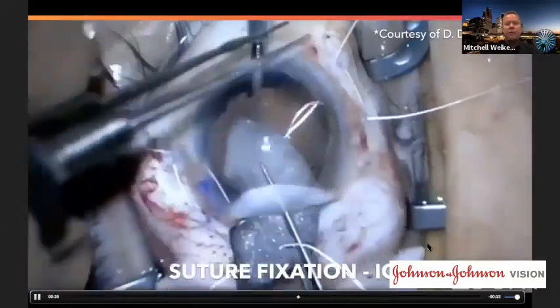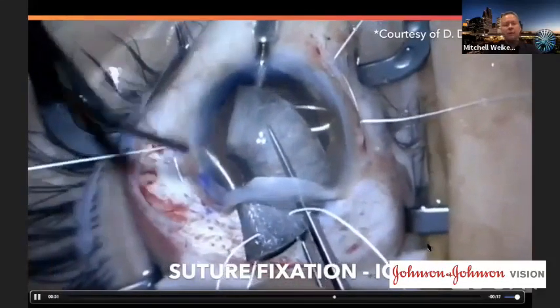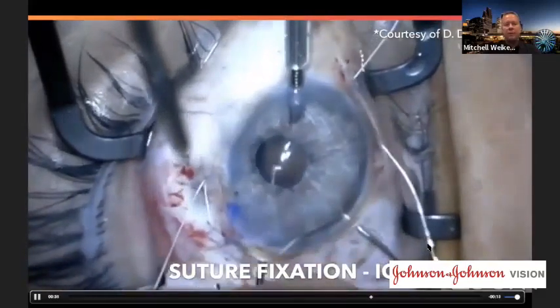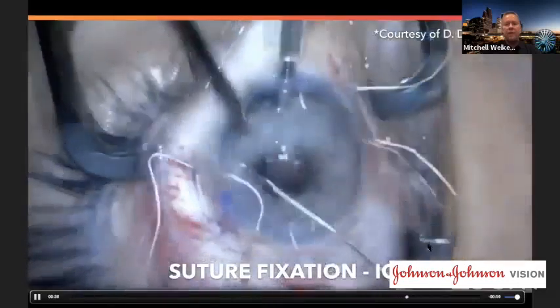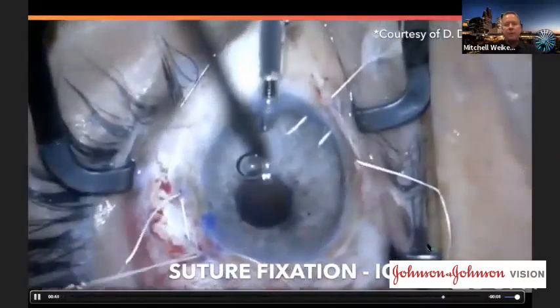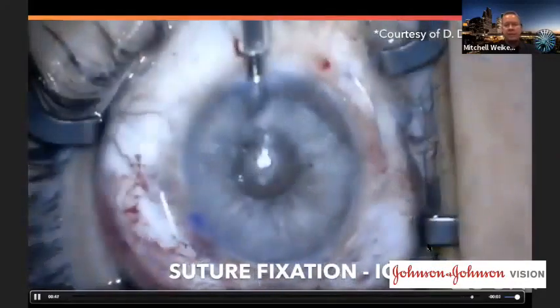If we're going to put it through a smaller incision and fold it in the eye, we're typically going to fold it into thirds. Once we get it in there, we're going to sweep it with a Sinsky hook or a second instrument and take our time unfolding this, making sure to get it under the peripheral residual iris tissue here. And then we're going to pass our Gore-Tex sutures again out through these paracenteses and tie it again.